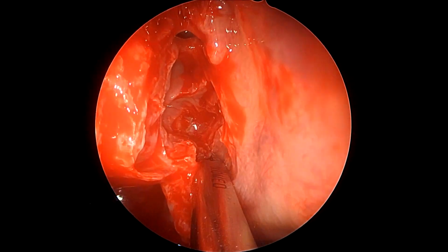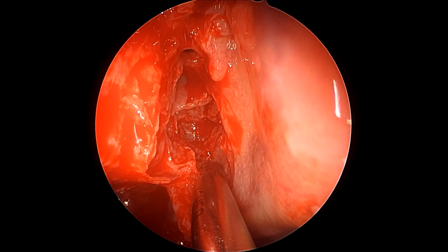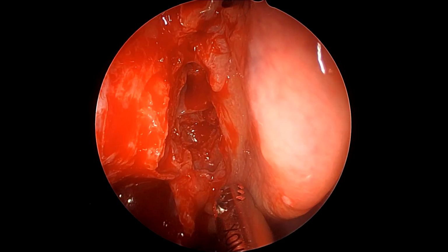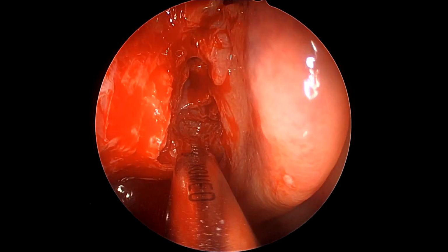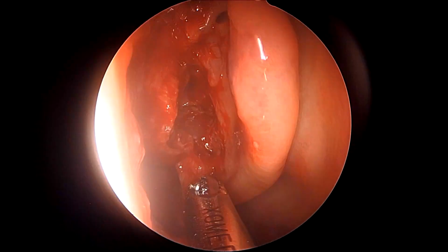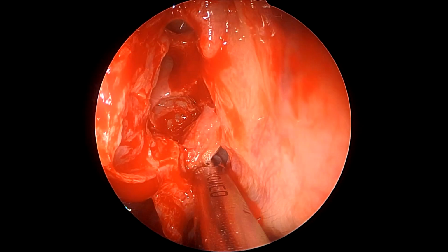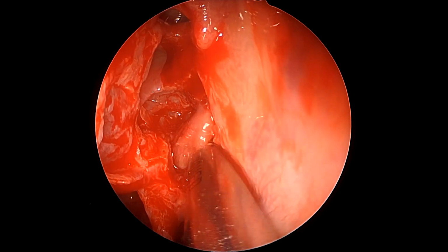One of the most fundamental anatomical landmarks that we ought to see once we go through the basal lamella and remove it decisively, is normally the superior turbinate. And the superior turbinate can be seen on the CT as well as intra-operatively. Lateral to the superior turbinate, we have the drainage of the posterior ethmoidal sinuses. Medial to the superior turbinate, we have the sphenoid recess with a sphenoid sinus trace. Here you see this is the superior turbinate, which our microdebrider blade is gradually dividing.